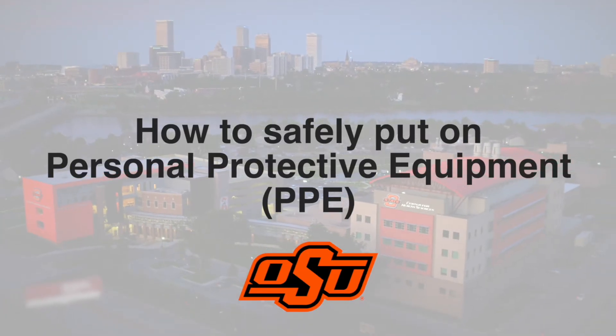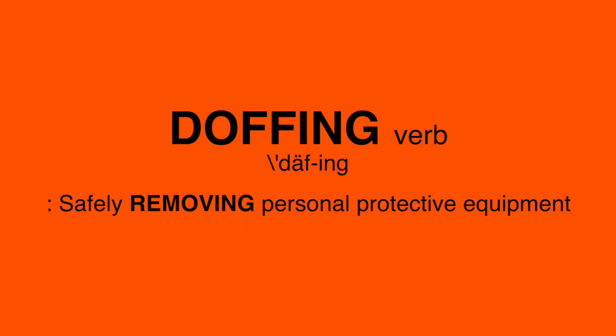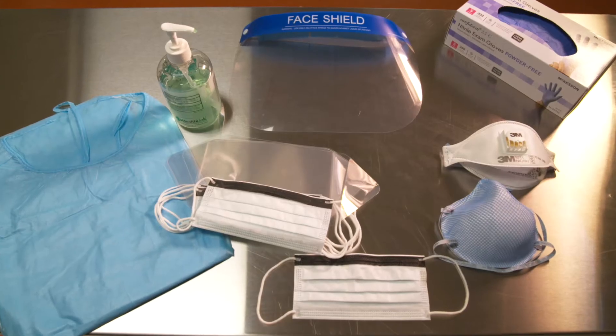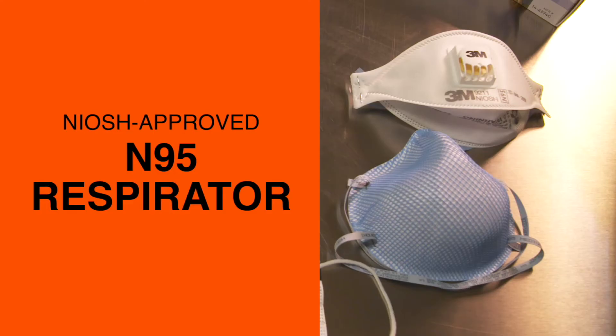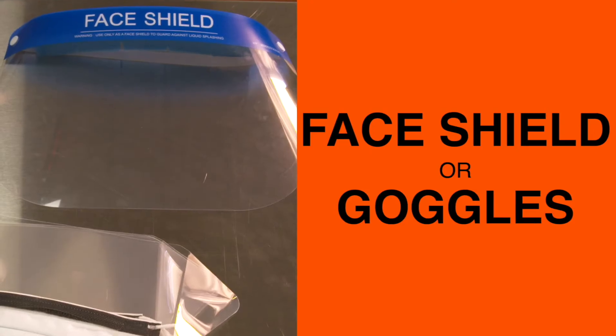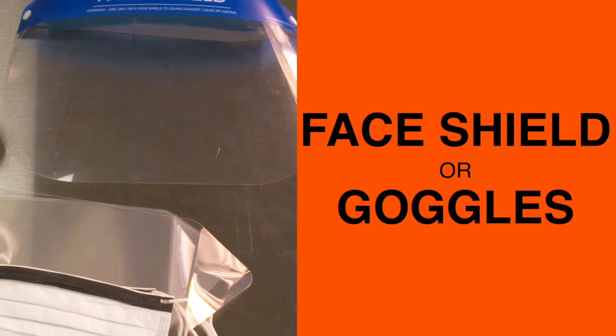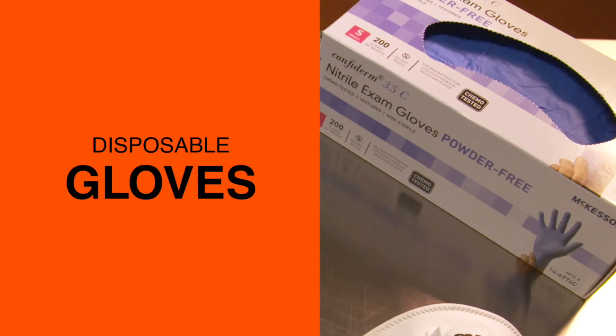There are several key steps when you put the equipment on, known as donning. It's just as important to take it off safely, known as doffing. First, identify and gather the proper PPE to don. This includes an appropriately fitted isolation gown, a NIOSH approved N95 filtering face piece respirator, or higher level respiratory protection. If a respirator is not available, use a face mask. You'll also need a face shield or goggles — some facilities might have a face mask and face shield combo. Finally, you'll need a pair of disposable patient examination gloves.